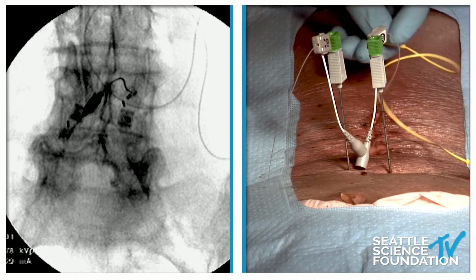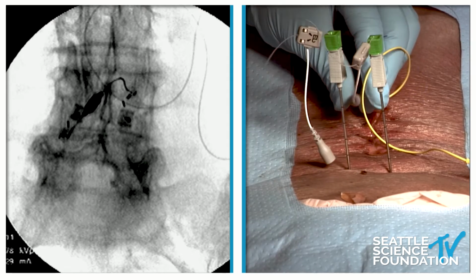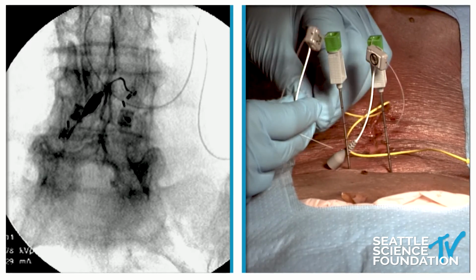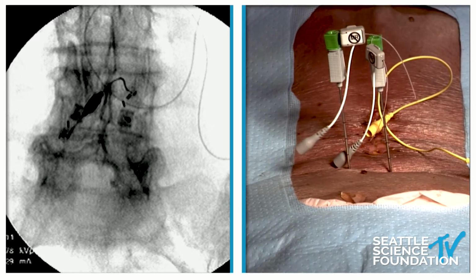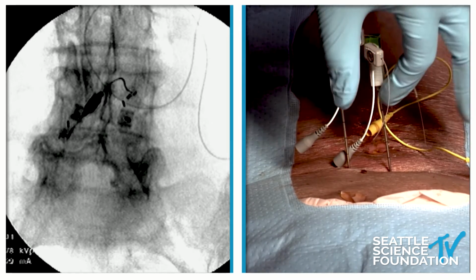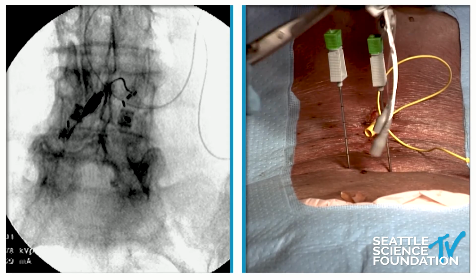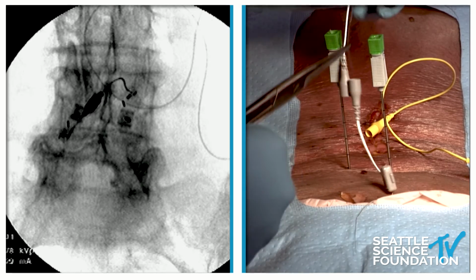And then what we can do again, connect MagSafe, making sure the lead looks good. And again, we'd externally program. All right, we've got the twitches. Yay. Mr. Jones, I hope you are liking that. We'd check with the other one. Again, check for twitches. And now the fun part. So now we know our leads are good. And so what we'll do is we will cut here between the box and the lead. And of course, they're magnetic, which I love, which is really cool.